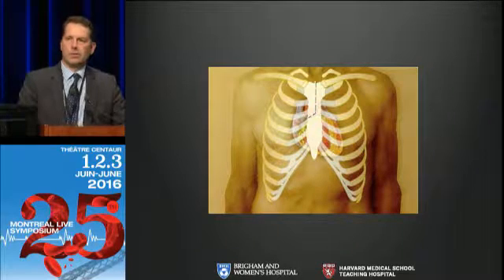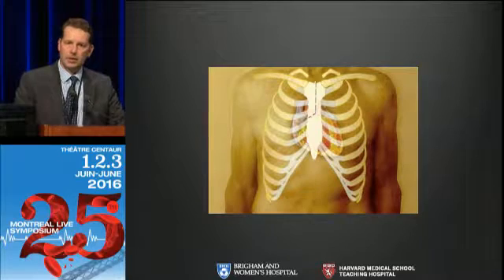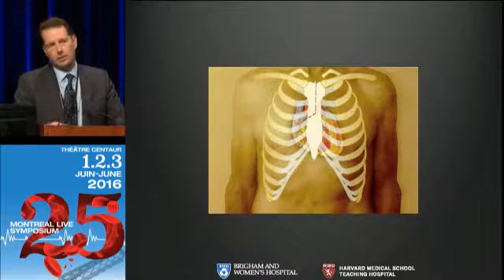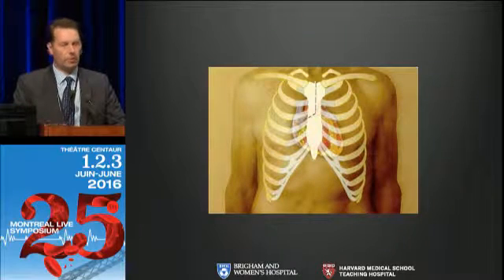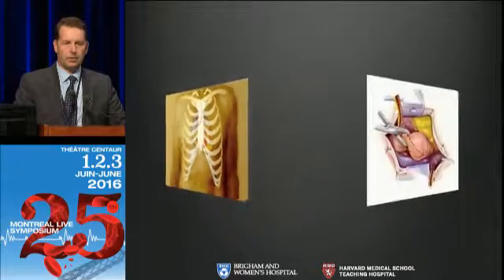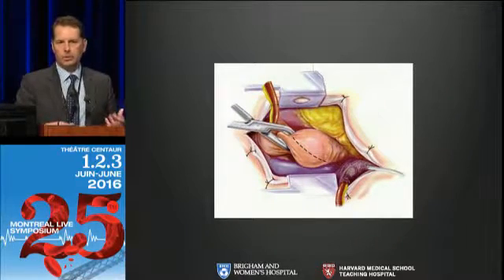Through that incision, which is certainly where I am now at the Brigham, there's a series of now over 2,000 patients having had this incision for aortic valve replacement with results that are propensity matched. They're not randomized, but are equal to the open aortic valve procedures, usually from the sternal notch to the fourth intercostal space. And through this, as surgeons, we can do most things that we would normally do through a sternotomy.